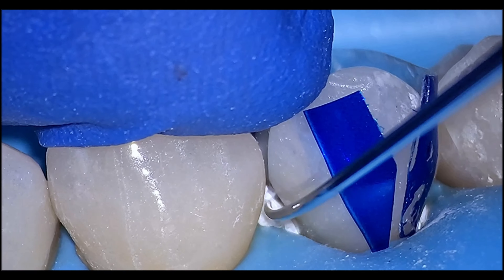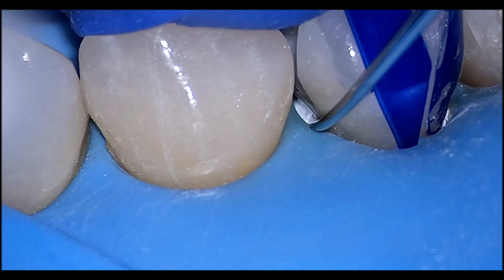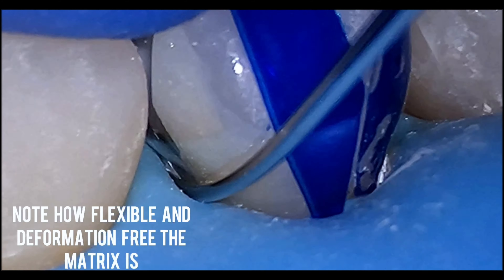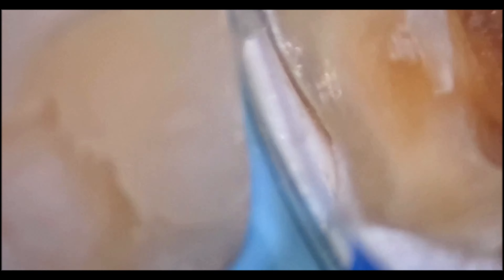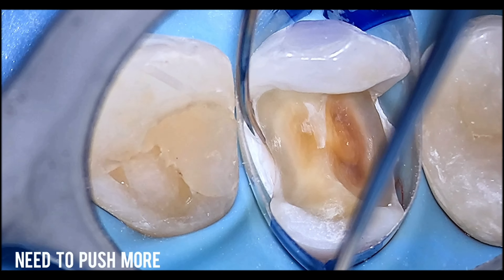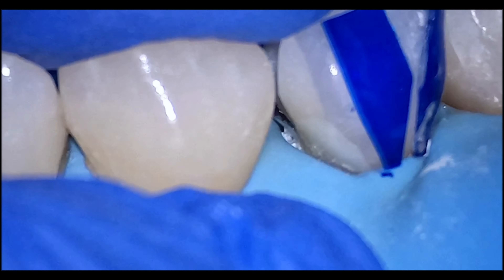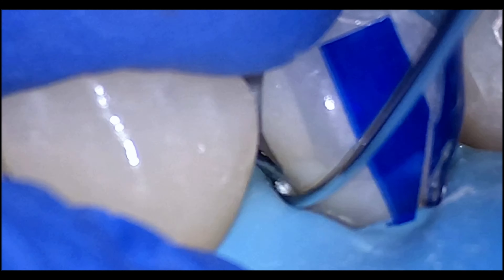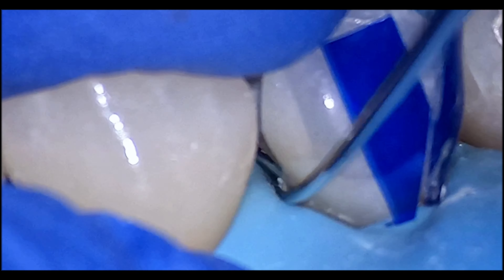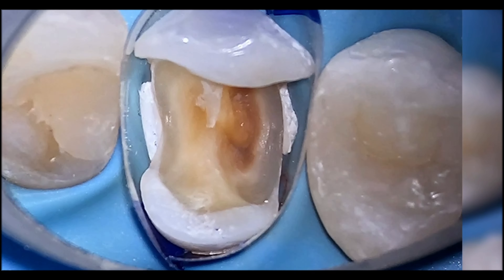Teflon is the one that helps you push the matrix into the concave area. We push it with a thin instrument — you can use a probe, an explorer, or a thin instrument used for fissure modeling. I checked with a mirror, and there was still a gap between the matrix and the tooth, so I added more Teflon and packed it further into the mesial aspect.